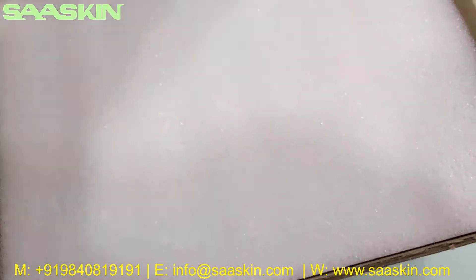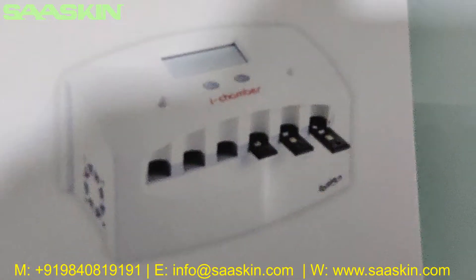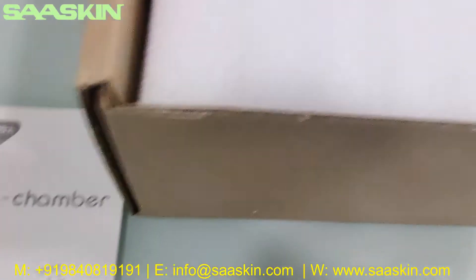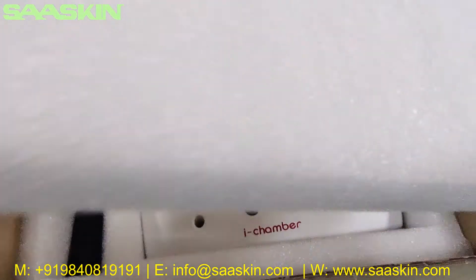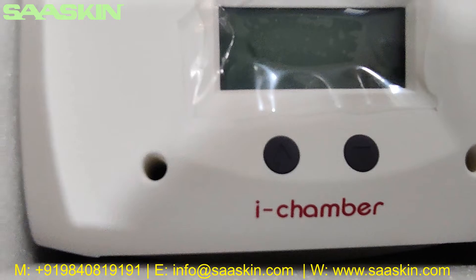Inside you can see there is one complete instruction manual for the i-Chamber. And I'm very much nervous. You got the machine here, you can see the machine.